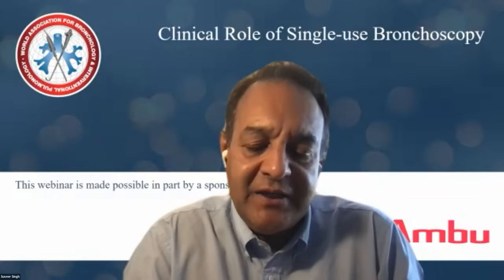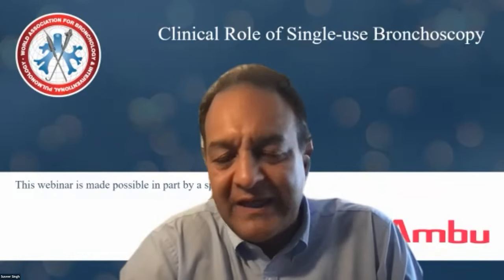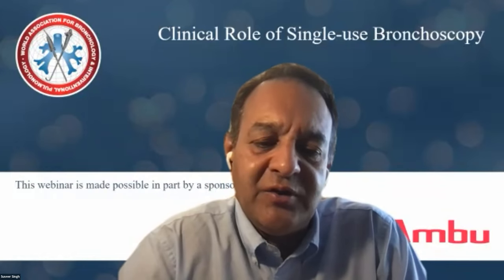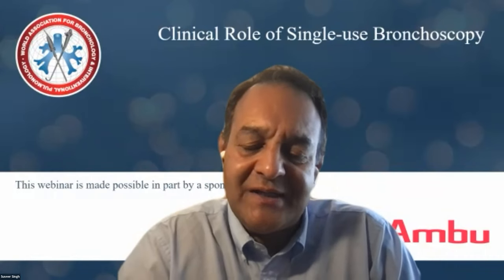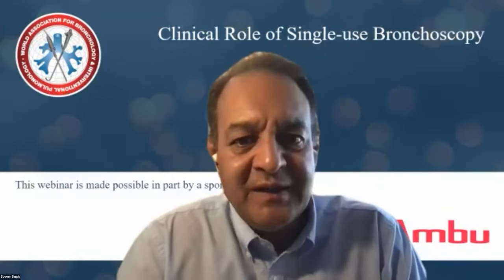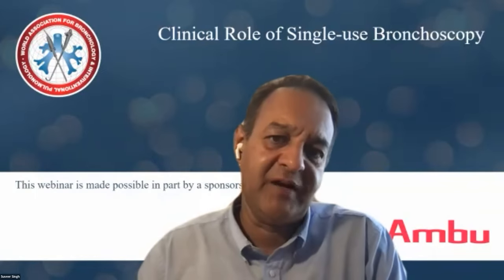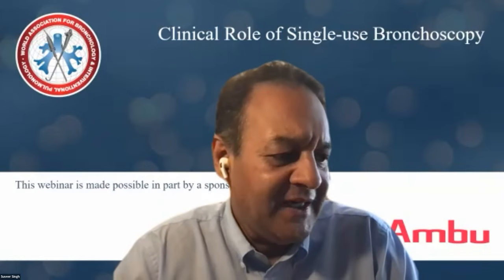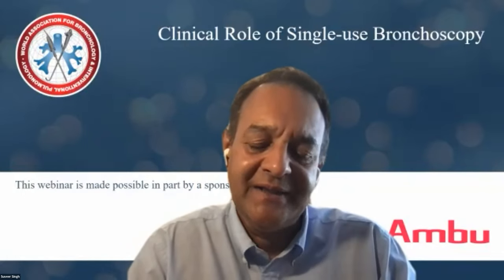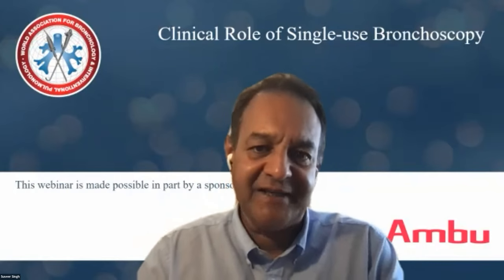Just in terms of the interesting question about how procurement in different organizations, what that's going to be based on. It's usually based on a lot of the stuff that Jonathan has already alluded to. But then, how does one balance that period of time of transitioning where you will be using both types of system, right? Which will inevitably lead to an increased cost upfront until someone has made that decision to wean down and off the reusable system in that particular environment. And that's a challenging one, right? I've seen some calculators online to sort of facilitate that type of work. But I think that's where the conversations need to be: clinician, procurement, purse string holder, and industry, right?